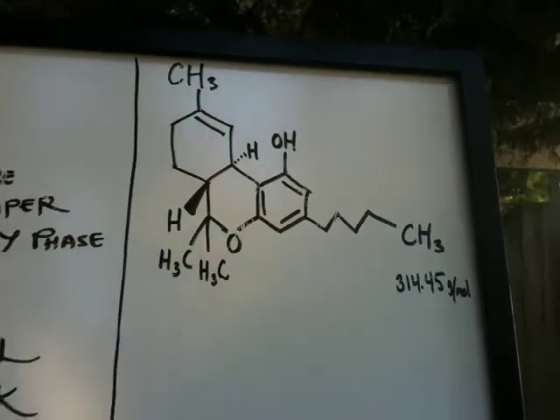After the process of mass spectrometry, when the weight of each molecule in urine is provided, the analysts match up which molecular weight goes with the specific compound. When the weight of THC is provided, it is easily identified as being the illegal drug in marijuana. Thus, unfortunately for you, you will be dismissed from your job.